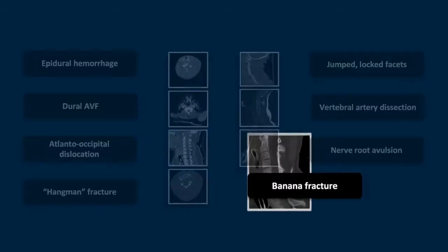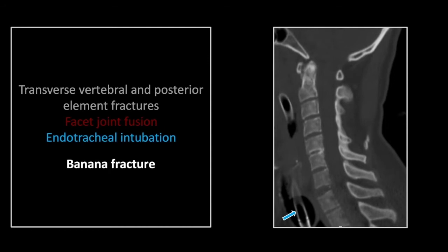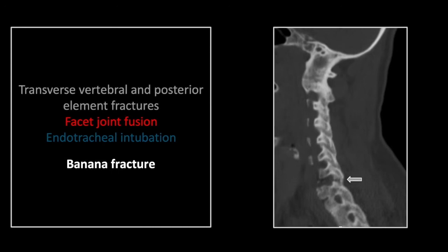Our last case is a complication of severe ankylosing spondylitis — the banana fracture. You can see there is widening and asymmetry of this intervertebral disc space. Note the presence of the endotracheal tube, which is almost always present in banana fractures. I have seen a large number of these resulting from intubation, and it's safe to assume that when you see one of these fractures in the presence of a tube, they perhaps occurred simultaneously. Attention is drawn to this fracture by its involvement of the posterior elements.